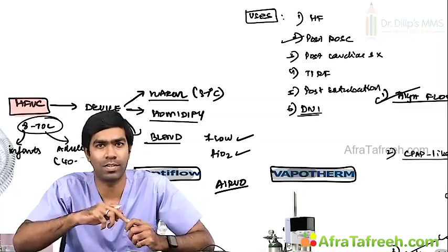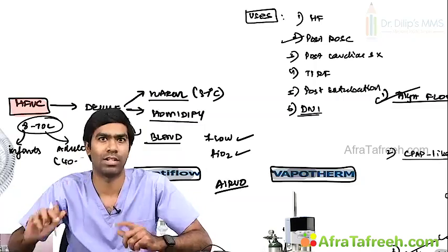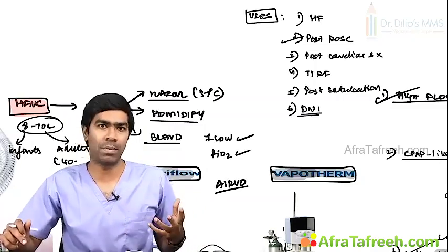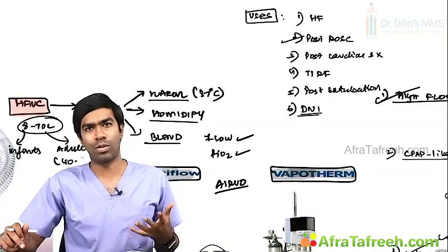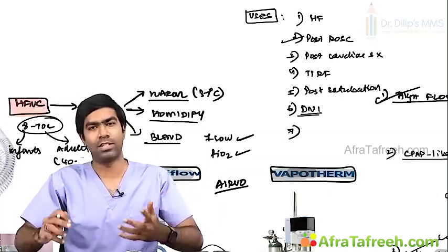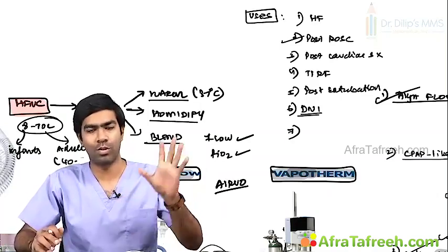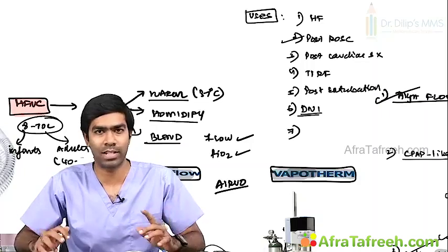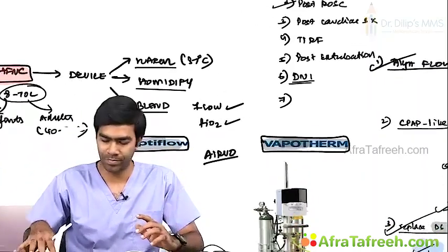An alternative to intubation itself. It can act as an alternative to NIV itself. That's being told nowadays. There's a trial going on right now, whether it can be a suitable alternative to CPAP and BPAP. Such a good device this is. That's why I am really a big fan of this HFNC. It makes the patient look much better. That's it. So immediately the patient will get better. However sick they are, at least they may get relatively better.